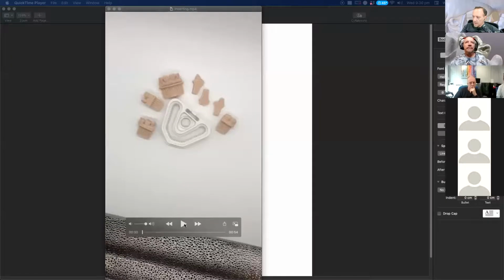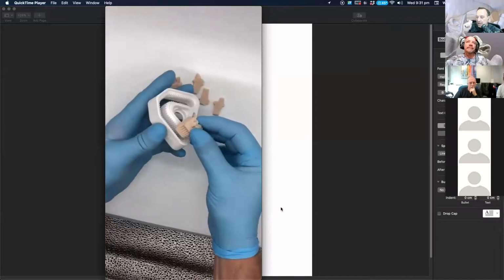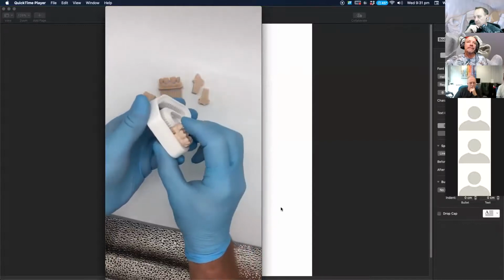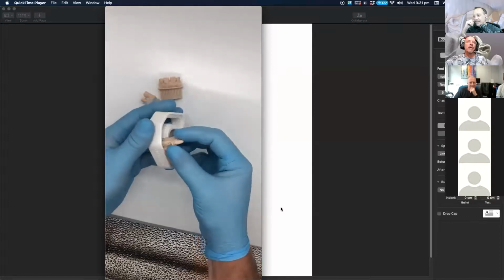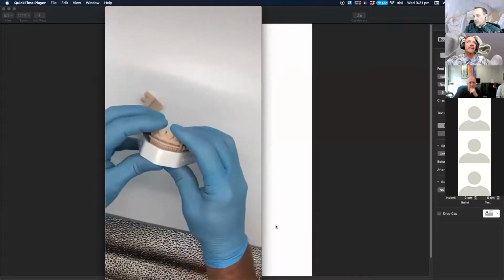I'll just play this video first. So share screen, just a minute. Okay, so can you see it? Yes, I can see it. Okay, so this is where I take them freshly printed, and all I've done is I washed them, and then you can just snap them into the base. Can you hear the sound effect? No, I can't. It's not playing, your computer sound is muted, I think. Never mind. So you can just push them in there like that.